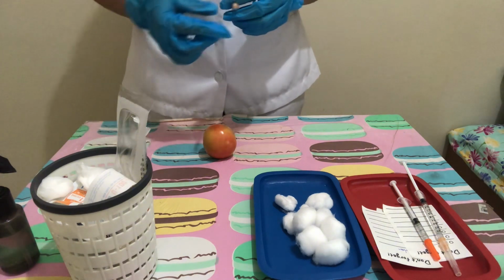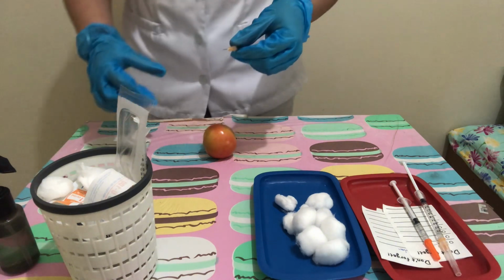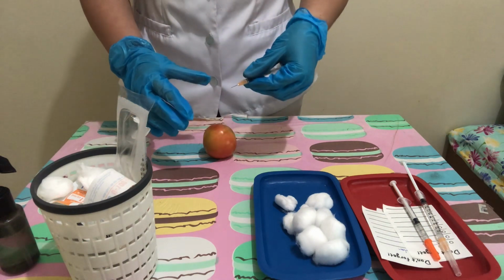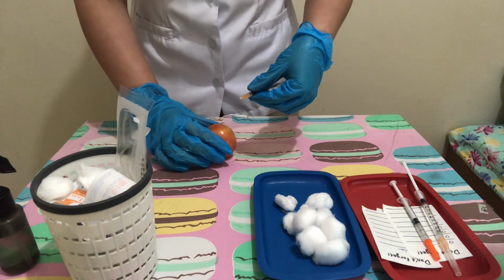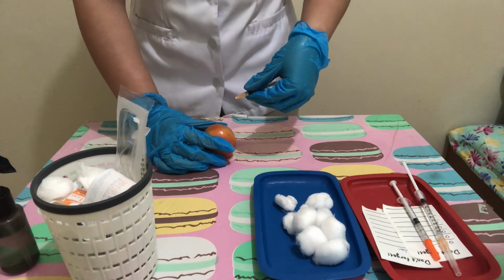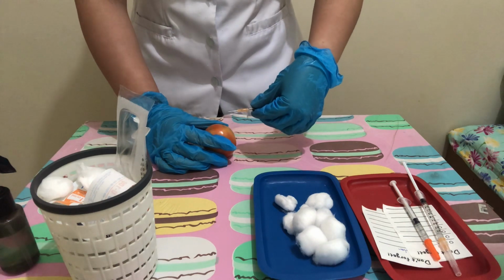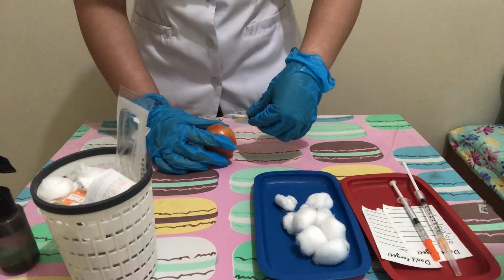Alright, now grasp the syringe in your dominant hand close to the hub, holding it between your thumb and forefinger. Hold the needle almost parallel to the skin surface with the bevel of the needle up. With the non-dominant hand, pull the skin at the side until it is taut, and then insert the tip of the needle far enough to place the bevel through the epidermis into the dermis.